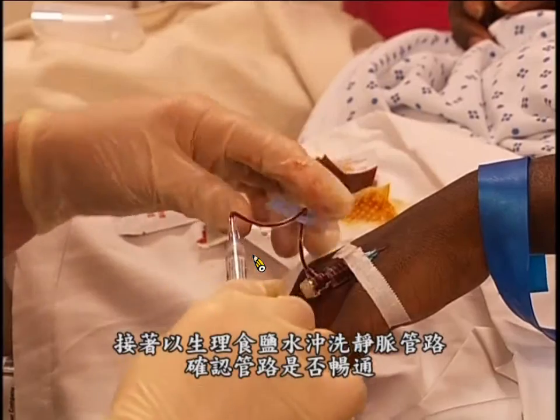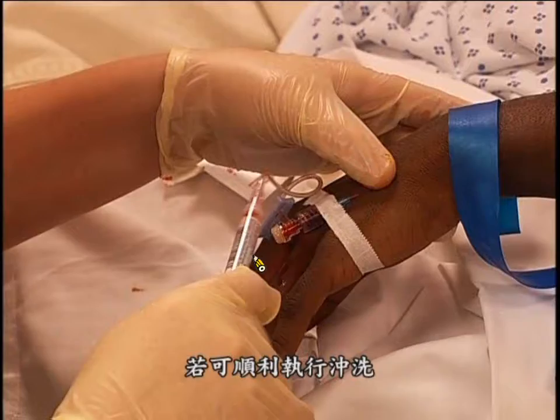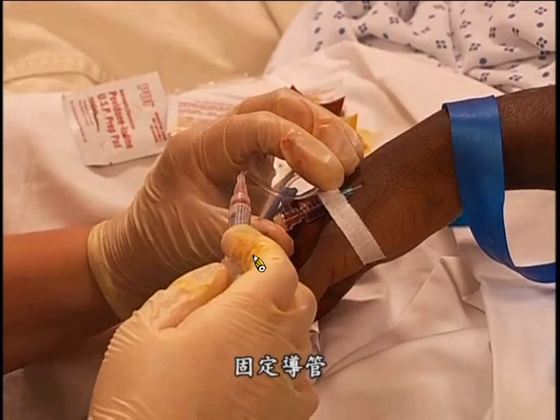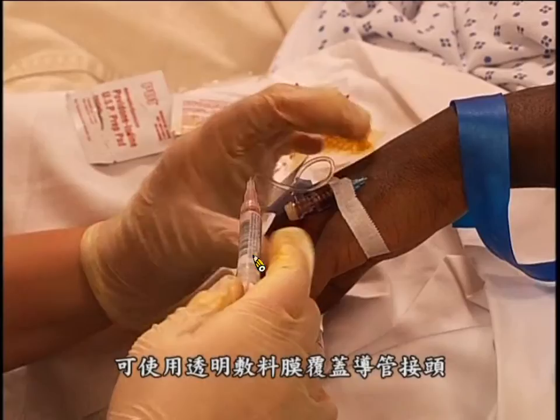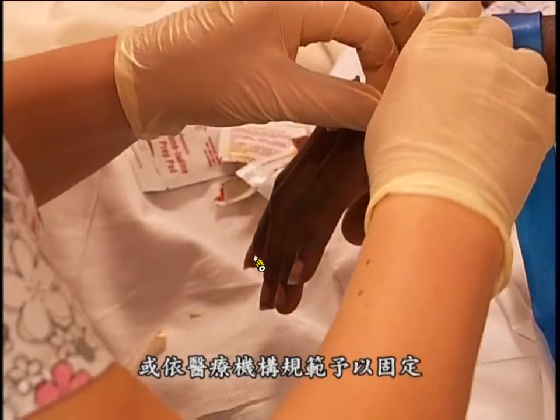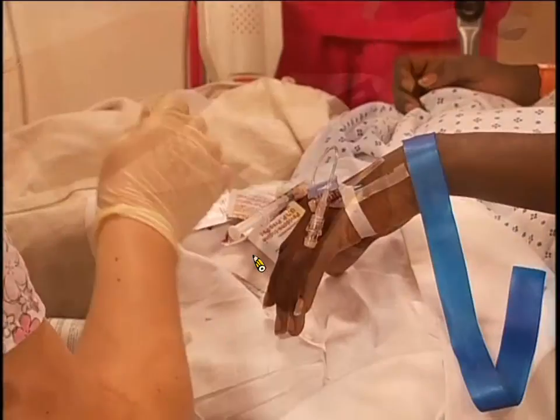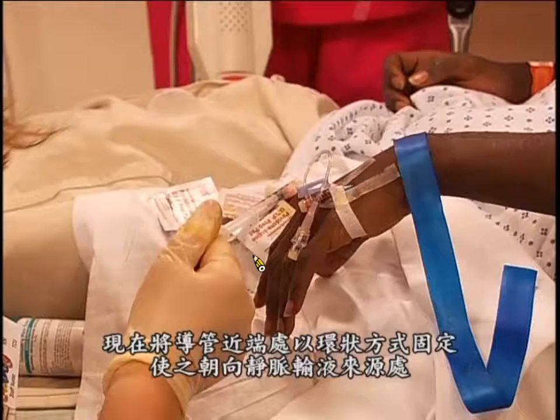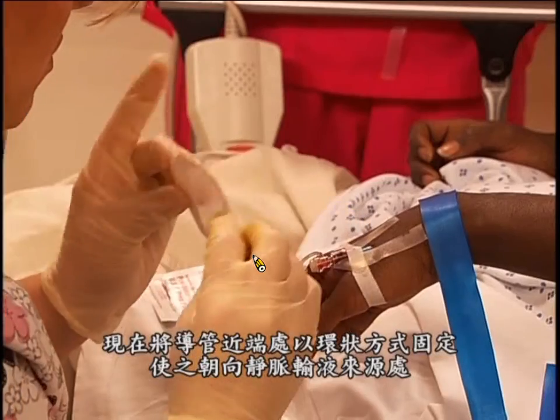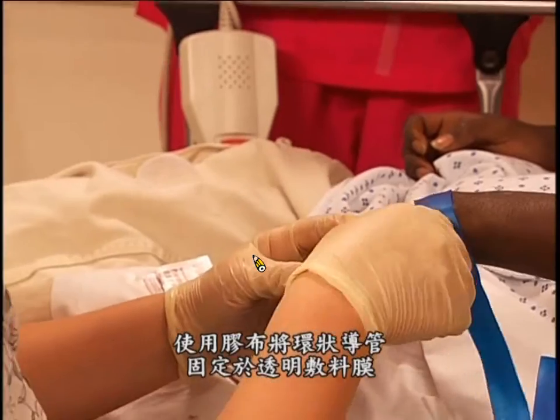Next, flush the IV line with normal saline to confirm its patency. If the line flushes easily, secure the catheter. To do this, apply a transparent dressing over the catheter hub, or tape it as required by facility policy. Now loop the tubing from the catheter hub toward the IV fluid source. Tape the looped tubing onto the transparent dressing.